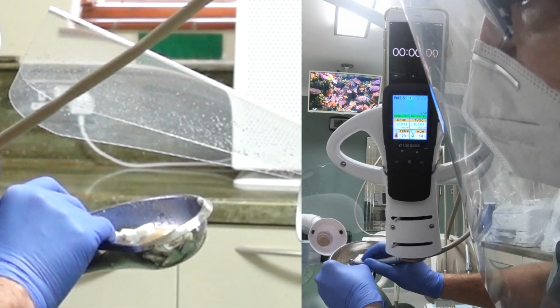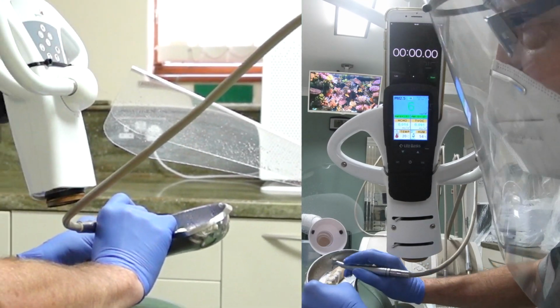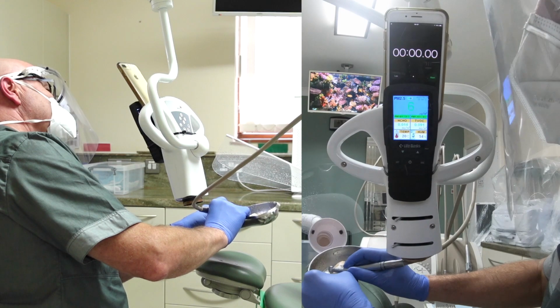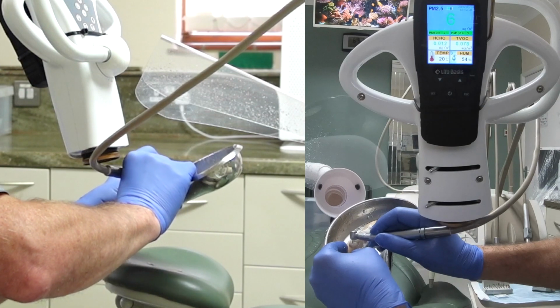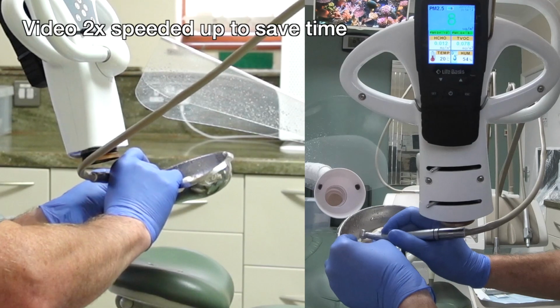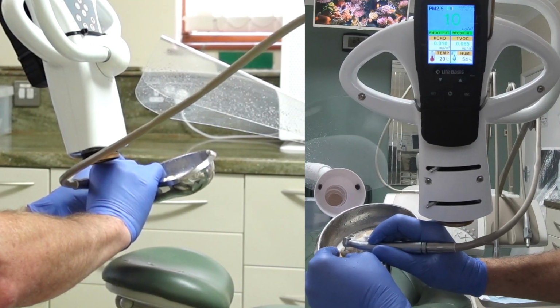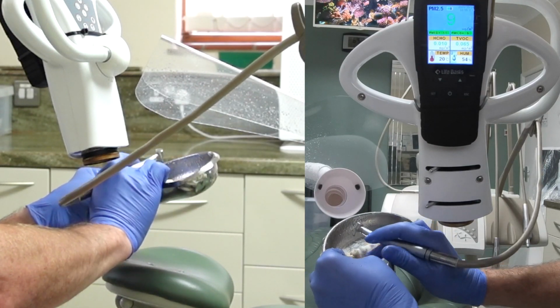Okay, we can see splatter on the inside of the aerosol. We're getting a lot of splatter here, but readings aren't really going up. And as you can see, I am destroying this tooth. Move a little bit of that there. Move this a little closer to the particulate meter to see if I can get some readings here at all.